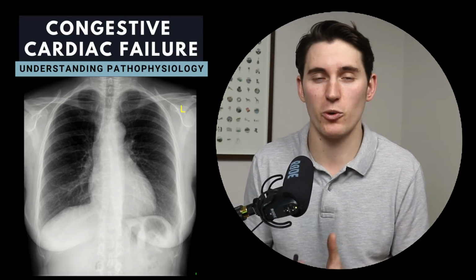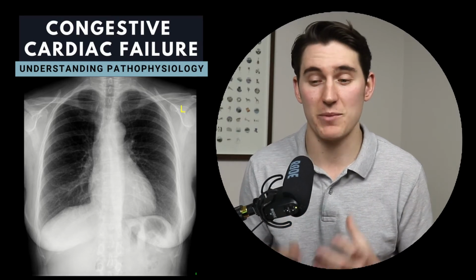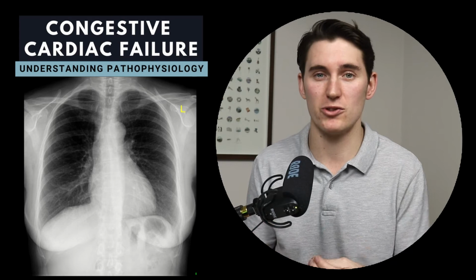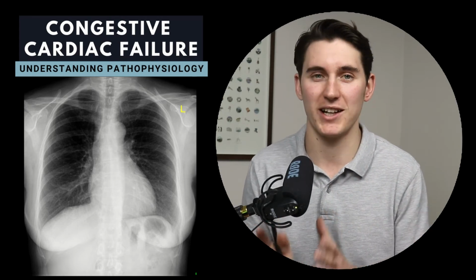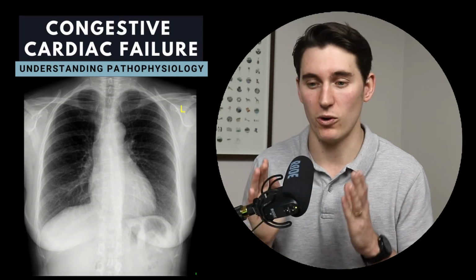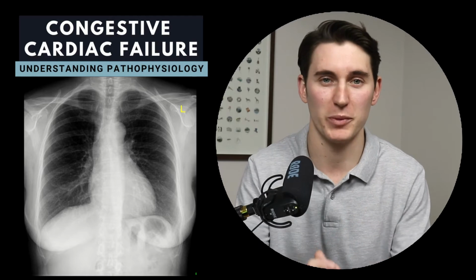Now I want to stress before we get started that congestive cardiac failure is a clinical syndrome. It's something that we diagnose clinically, and we can use radiographic features to supplement that clinical information, but we're not going to make the diagnosis on chest x-ray or on CT scan. We're going to use these features to help us supplement the clinical picture.